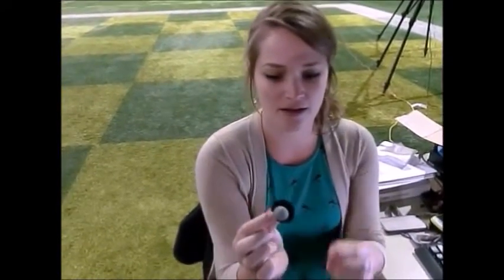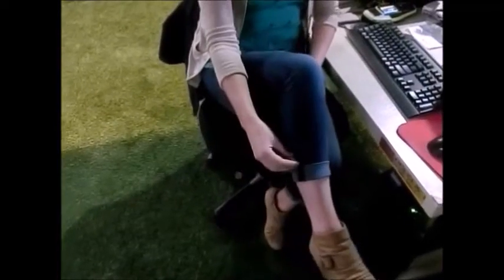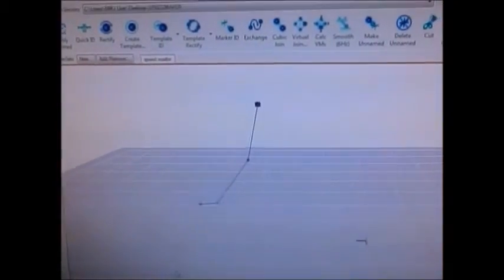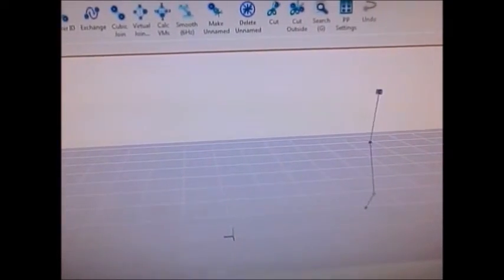So for the kinematics we look using the motion analysis system, which looks at cameras. We place reflective markers on a person's shoulder, their hip, their knee, and then their mid-shank, so that we can focus on the hip and the knee angles. If we look over here, this is our shoulder marker, this is our hip, our knee, and our mid-shank. So as we go through, we can look at the difference in the hip and the knee angles as they go through a stride when they sprint.